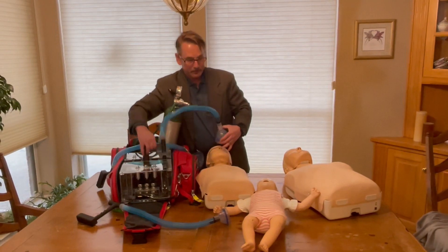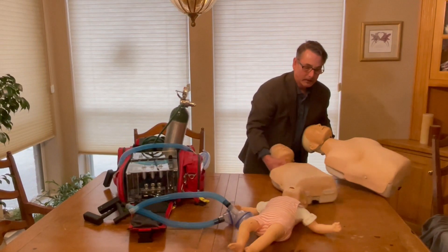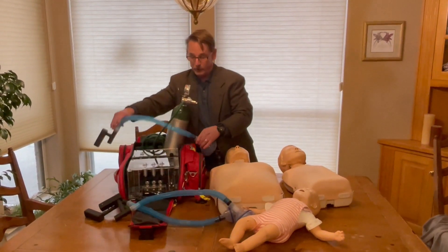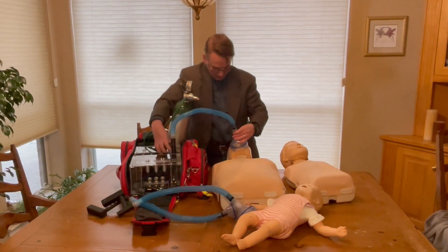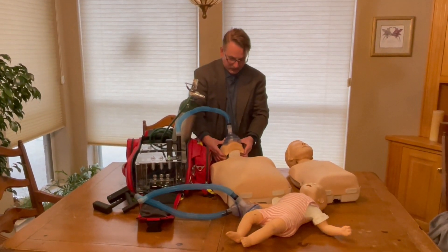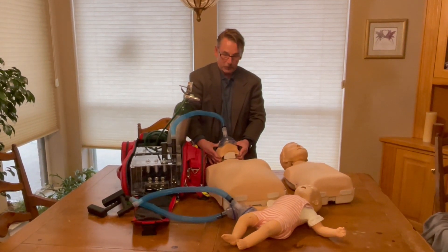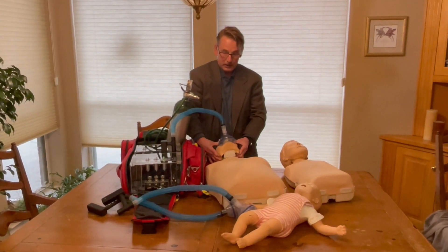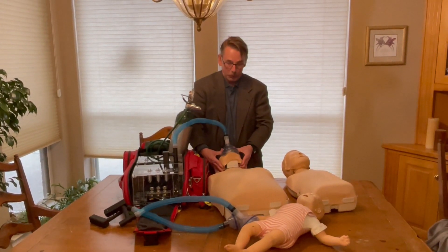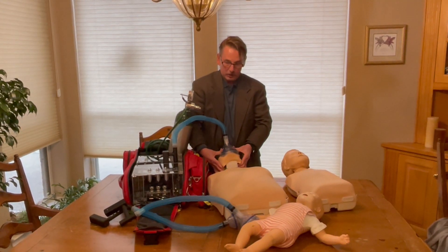For the adult, you simply select the adult mask. Because the respiratory rate is much slower, it takes a little bit longer to really see the effect. The rescue breaths here are given at 10 breaths per minute with a tidal volume of 600 cc. The breath is given over one second with five seconds for passive exhalation — again, 100% oxygen.